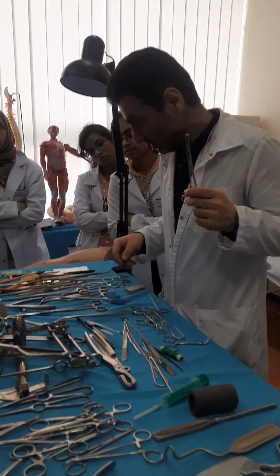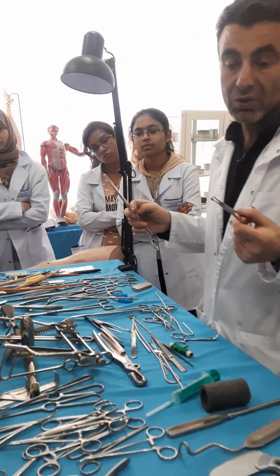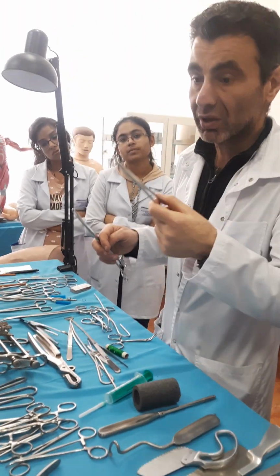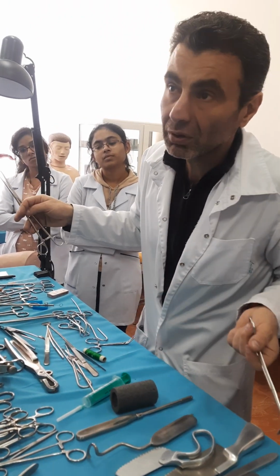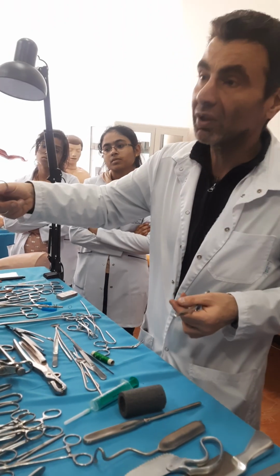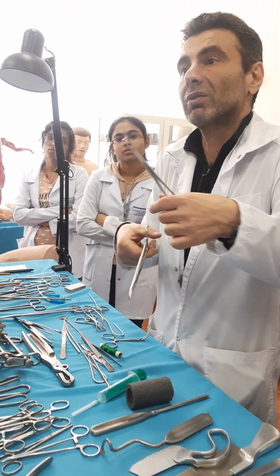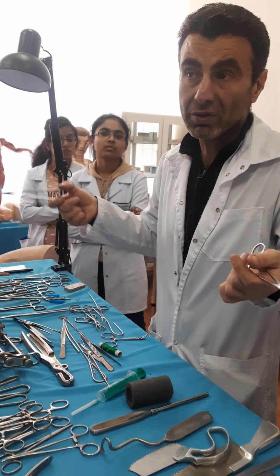Allis tissue forceps, uterine forceps. Both are used to fix removable parts of internal organs. Allis usually for the gastrointestinal tract, uterine usually for the uterus. That's why it's called uterine. With sharp teeth, it is inserted into the myometrium to fix it. For example, you make an extirpation or an ectomy in the case of tumors, cancers.